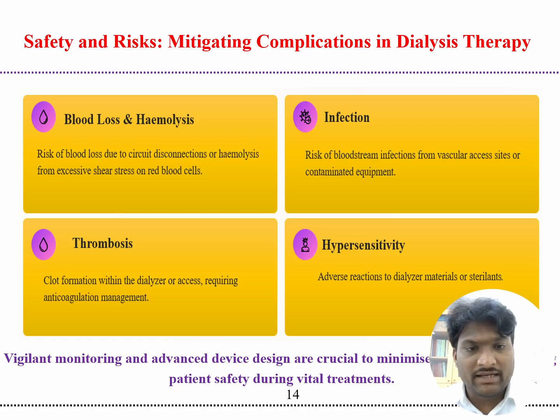And the safety and the risk, like mitigating the complications in dialysis therapy: blood loss, hemolysis, infection, thrombosis and hypersensitivity.